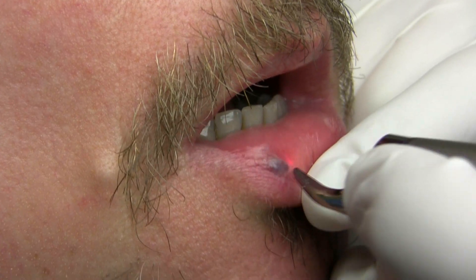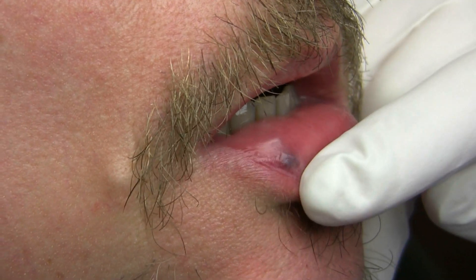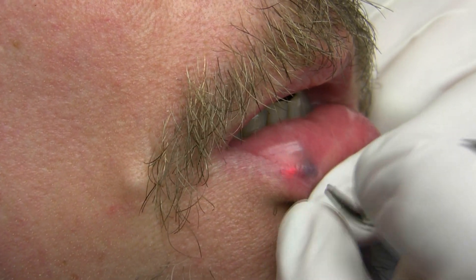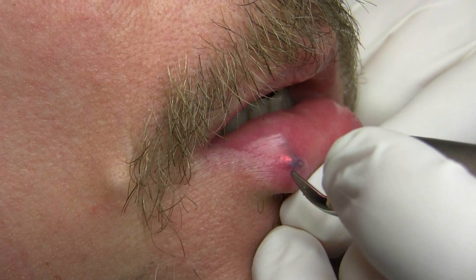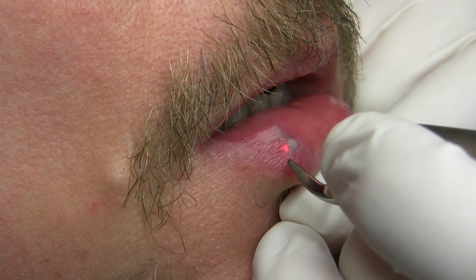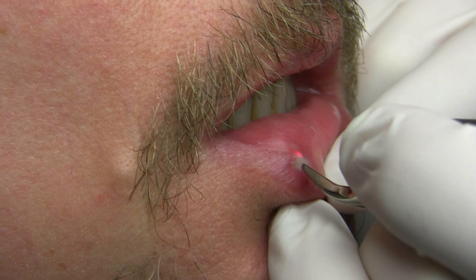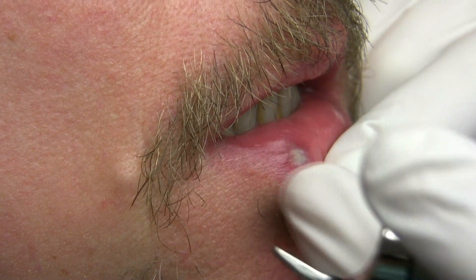This gentleman has a small venous lake on his lower lip, and we're going to treat this with the Iridex 940 laser. We're at 200. And we're going to zap it. You can see how it condenses the lesion immediately. Okay, we're done. Very good.